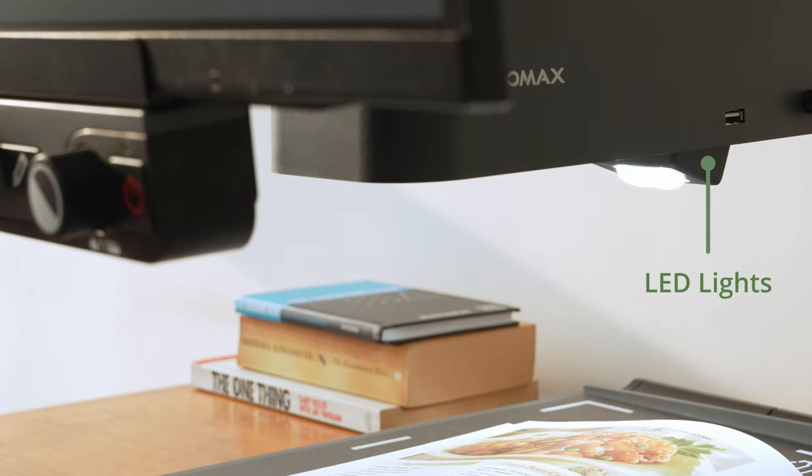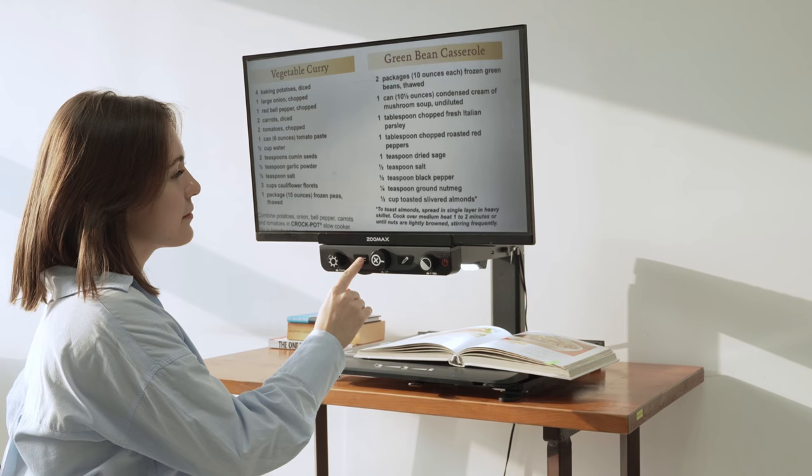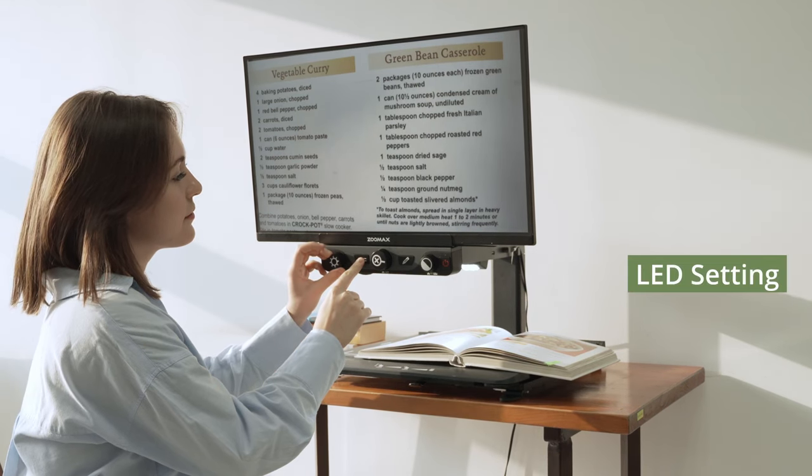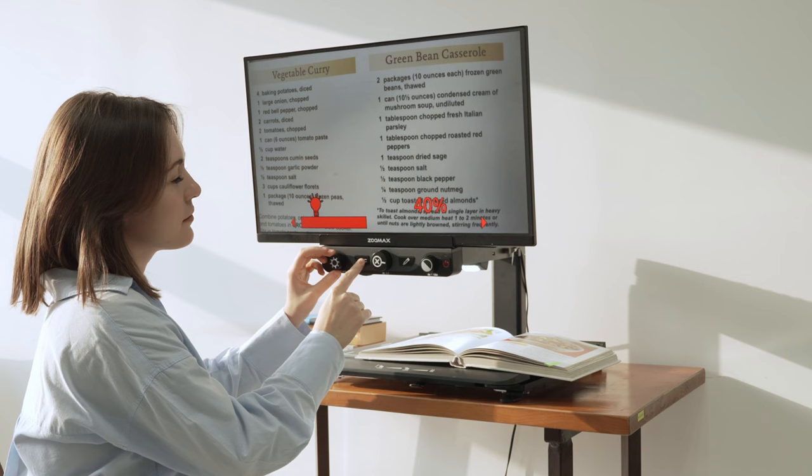LED Light Brightness Setting: you might require additional brightness in low-light conditions to ensure that content can be read clearly. Press and hold the Positioning Auxiliary button, then rotate the Brightness dial to adjust the LED light for your purpose.